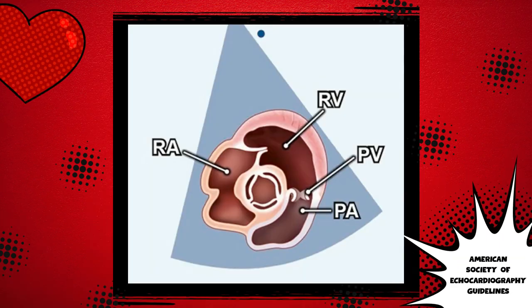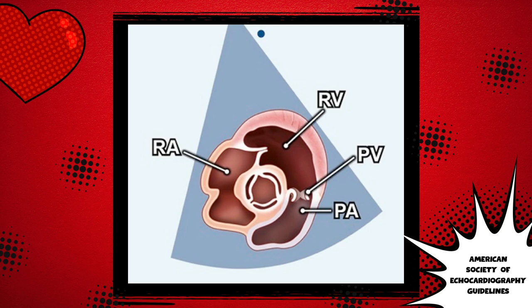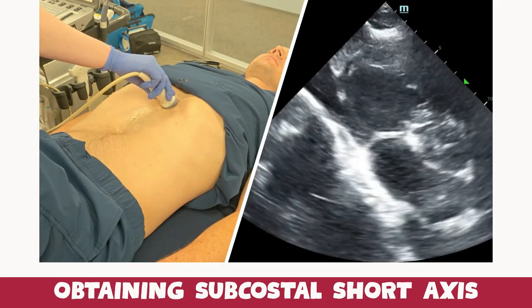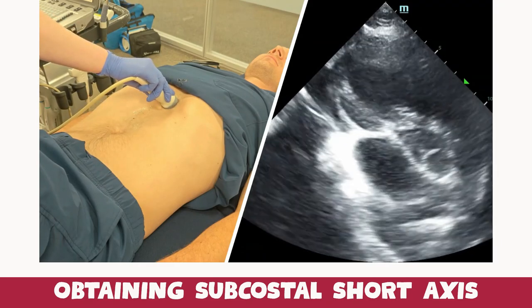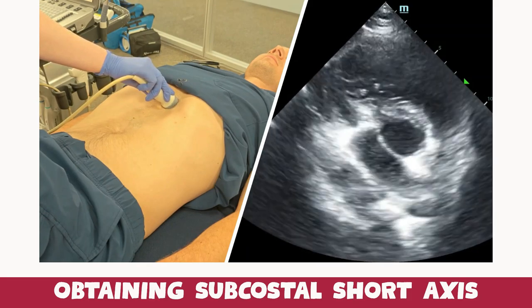So this is really our goal here. This is a schematic of what we're looking for: the right atrium, the right ventricle, the pulmonic valve, and then the pulmonary artery — that's our right ventricular outflow tract. I'm going to play a video showing how to obtain this view. Start out with our normal subcostal view, and then by rotating your probe about 60 to 90 degrees counterclockwise, you can get the view of the RVOT.